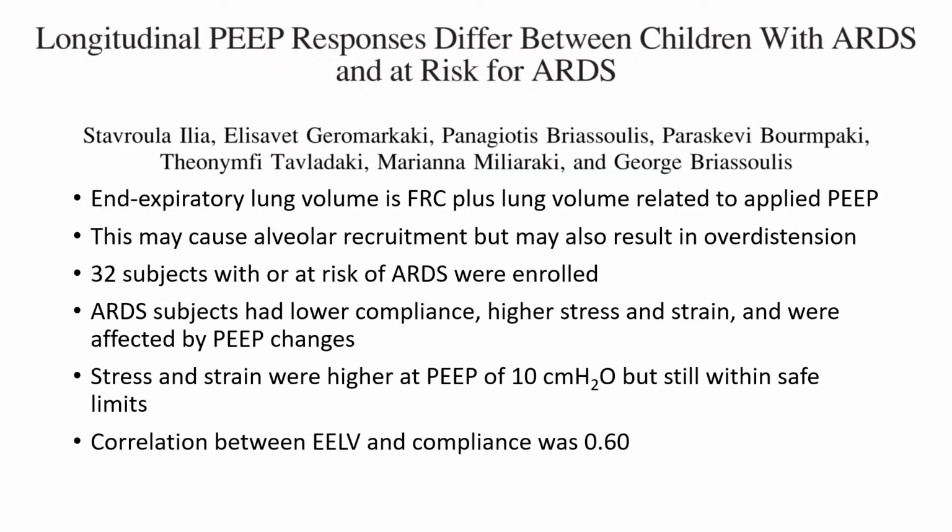And so another challenge in clinical practice is how to set PEEP and how to measure response to PEEP. Elia and colleagues did a study titled Longitudinal PEEP Responses Differ Between Children with ARDS and at Risk of ARDS. It's important to remember that our end expiratory lung volume is the functional residual capacity plus whatever lung volume is increased related to applied PEEP. And this can result in alveolar recruitment, which is good, but it can also have deleterious effects with overdistension.